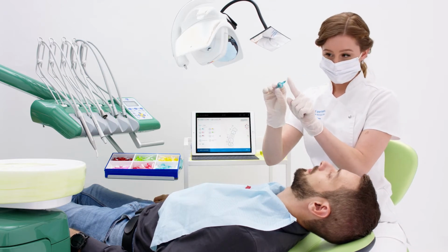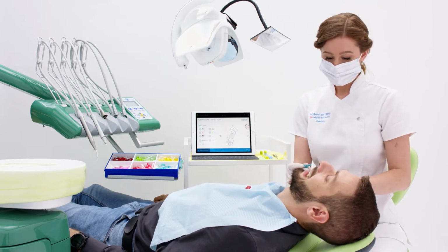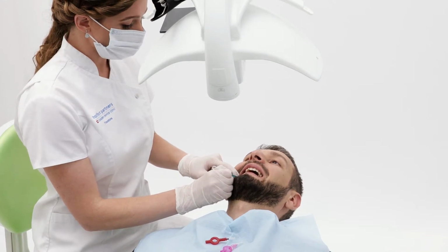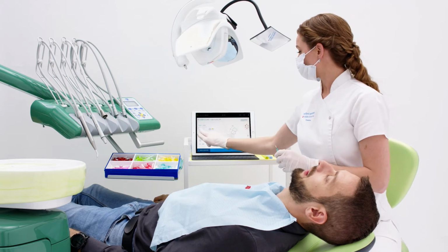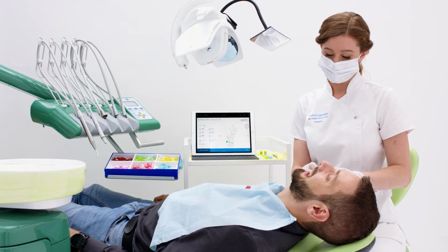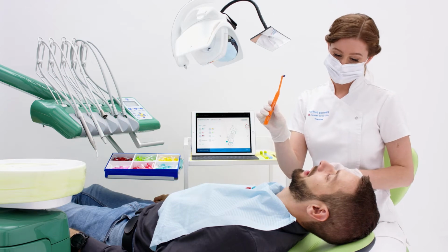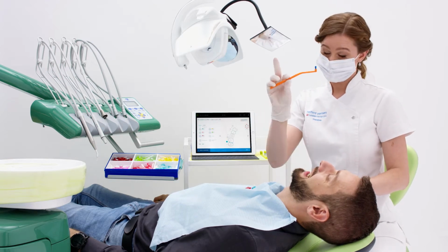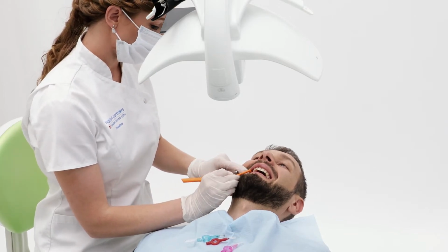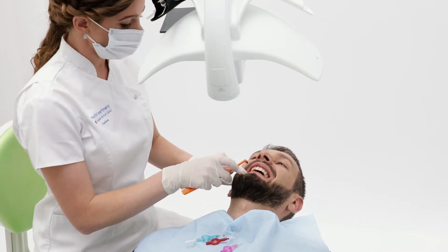I now begin with the Prime Turquoise Interdental brush and remind Edward to look into the mirror so that he can view the technique I am using, and also if there is any bleeding present when using the dental aid. I begin in the upper right sextant. I also recommend a single tufted brush, as Edward has a large interdental space here in this sextant. I demonstrate and explain to Edward how to use this brush here.